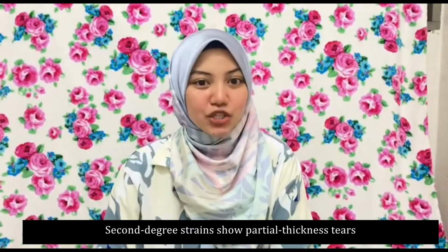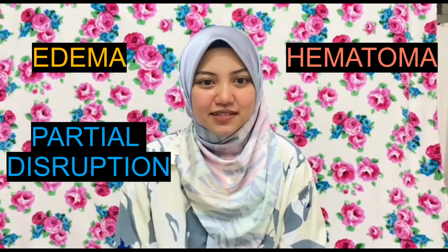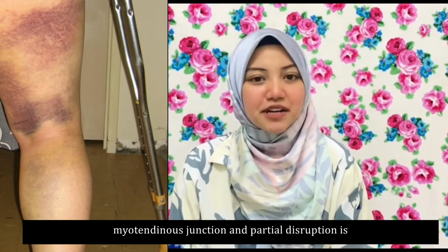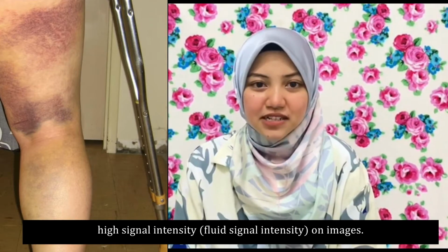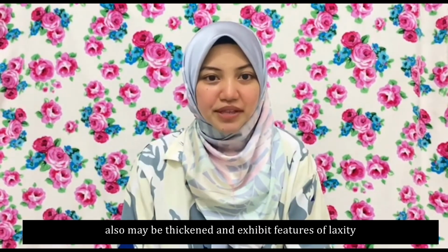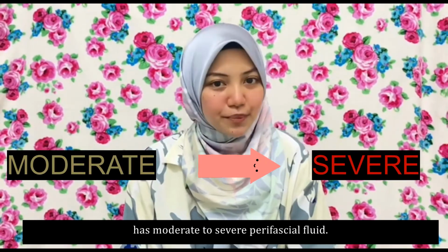Second degree strains show partial thickness tear of the myotendinous junction, manifested by edema, hematoma, and partial disruption. There is presence of a partial disruption of muscle with hematoma formation around the myotendinous junction, and partial disruption is usually depicted as a focal well-defined area of high signal intensity or fluid signal intensity on images. The tendon adjacent to the myotendinous junction also may be thickened and exhibit features of laxity and partial disruption. Second-degree muscle strain has moderate to severe perifascial fluid.